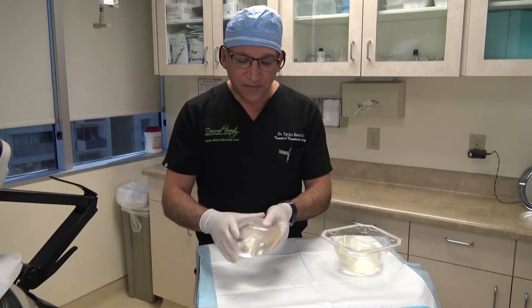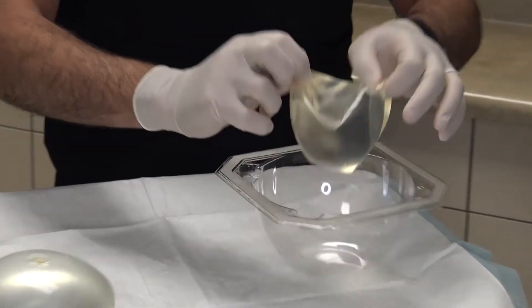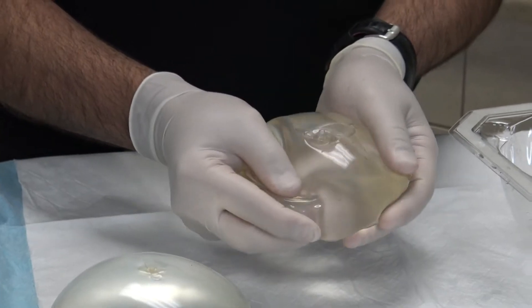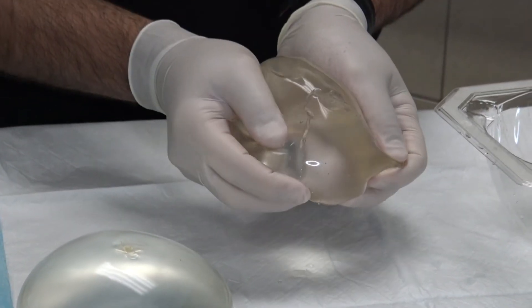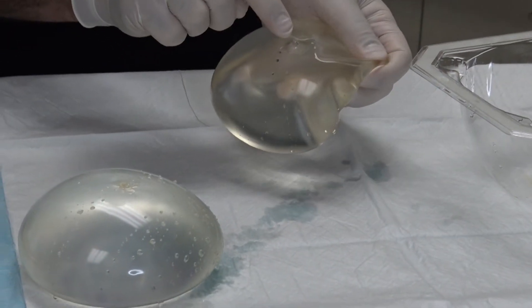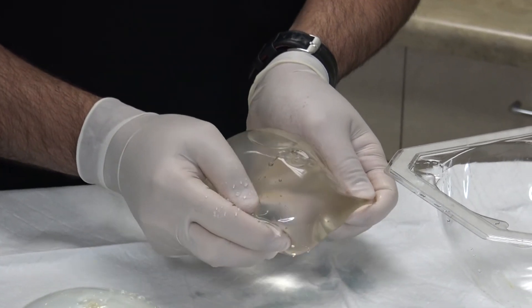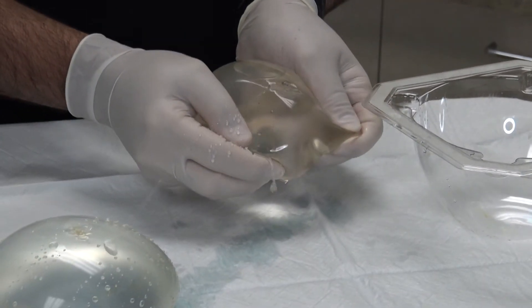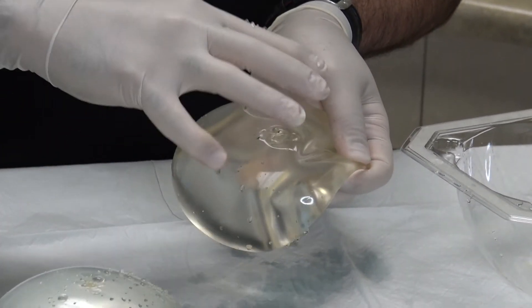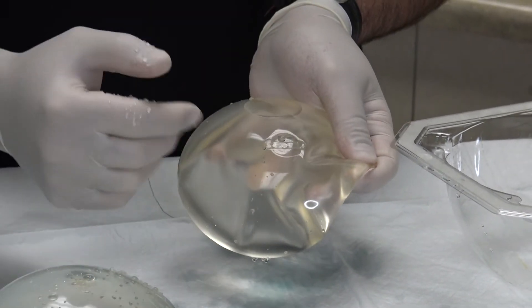This was the implant that she felt had gone down. When you squeeze it, you can see the leakage happening — it's usually through a deficient valve, or around the valve, that it starts leaking from the pressure of the implant. It stops when the pressure is low enough that it no longer pushes the saline out.